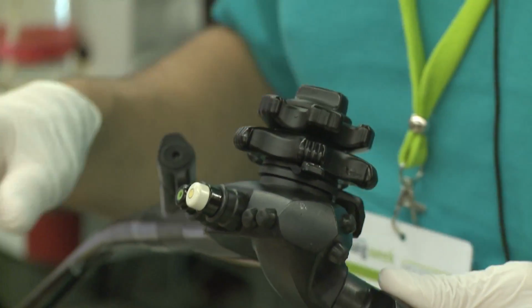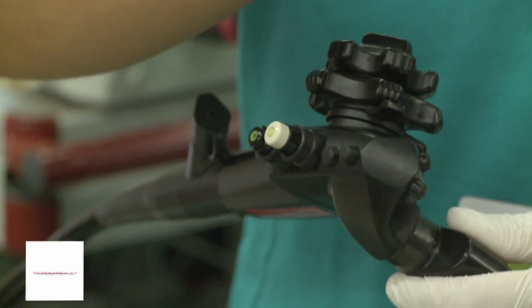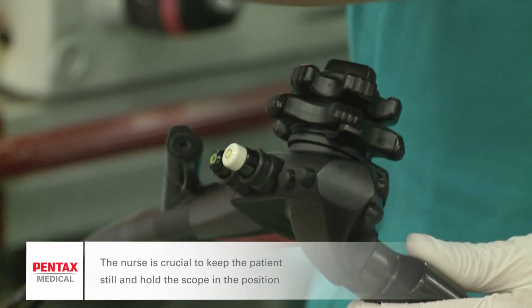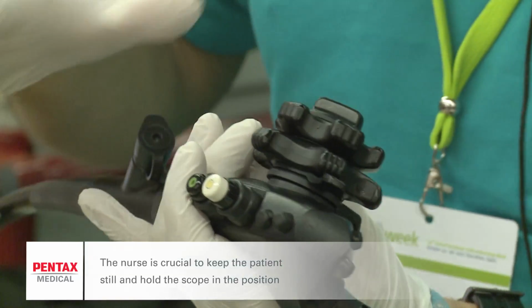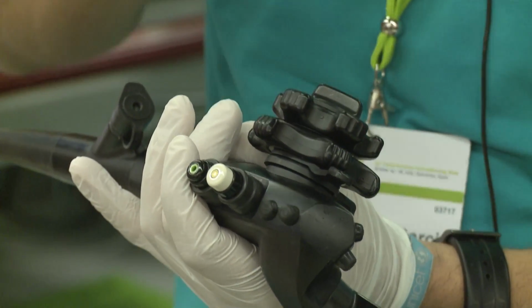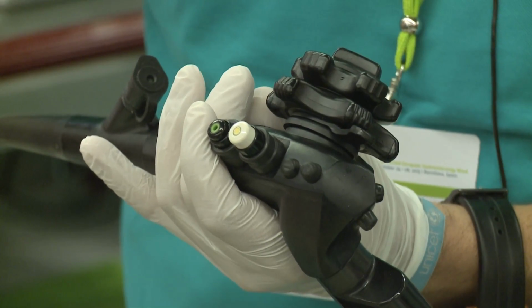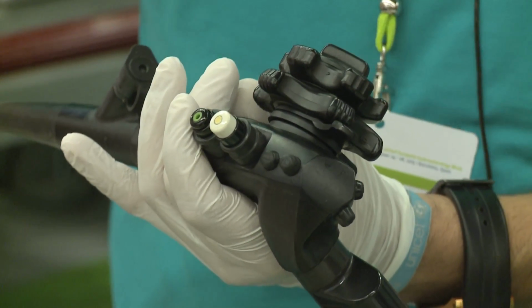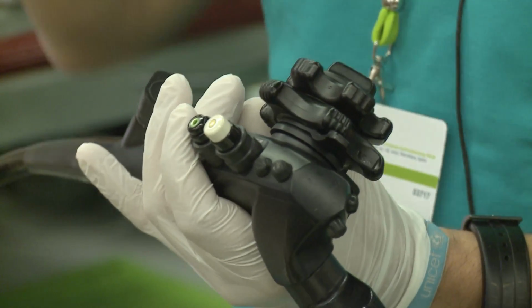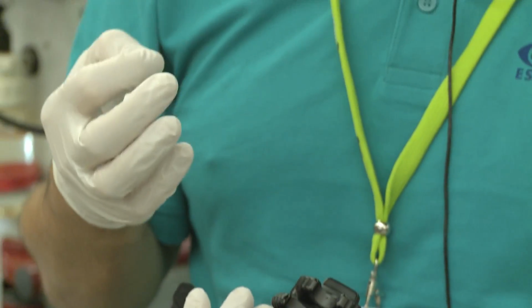This is a very quiet patient with a very good propofol sedation, so it's going to be very easy. But if the patient is not sedated, the role of the nurse is key. Because for me to take the needle, I'm going to need to keep my hands off the scope. The key point to keep the scope in position is the nurse, who will hold the patient and the scope from the very beginning and give me enough strength to be able to put the needle inside the lesion. So we will go.